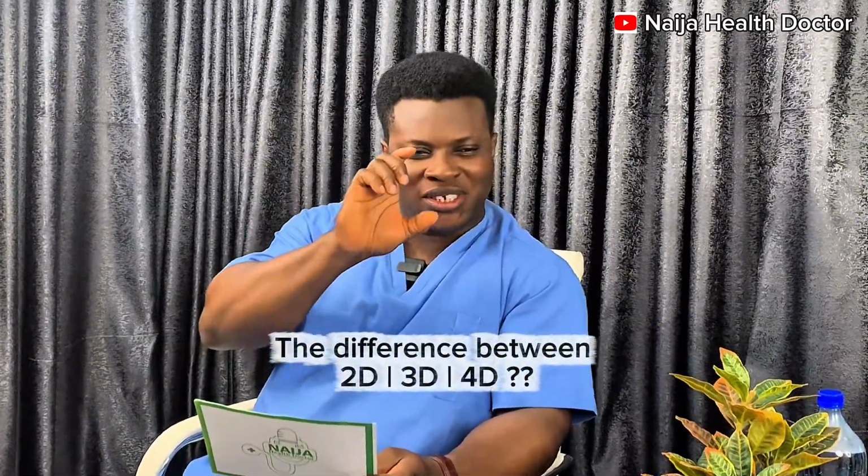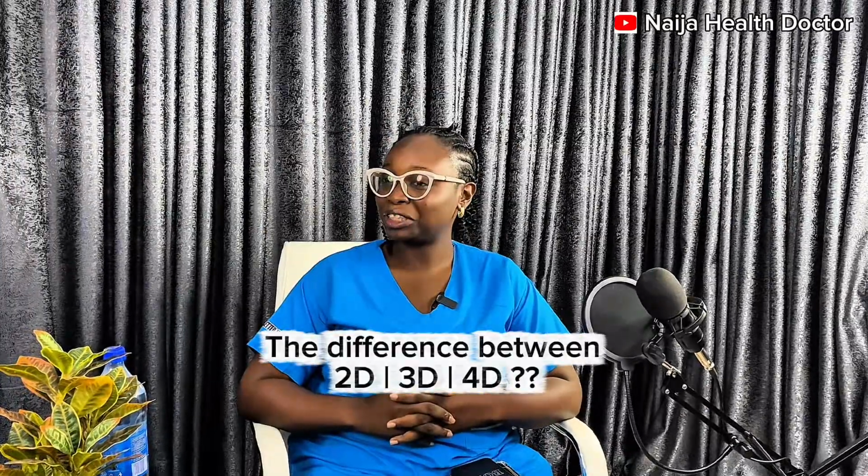So let's go to the difference between 2D, 3D, 4D. We've had cases where patients will come in and say, I want 3D, I want 4D, I want this D. Patients will tell you that. Do you have 3D? I don't know what they've read. They've consulted Google and a lot of research. They want 3D, they want 4D. Sometimes we convince these patients to do 2D, and that is what is medically essential. You still see their baby.